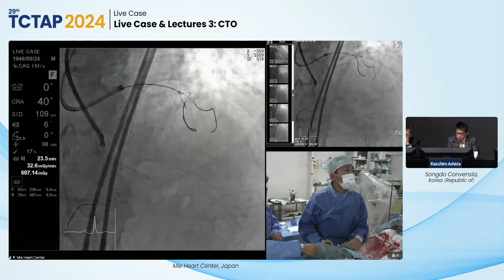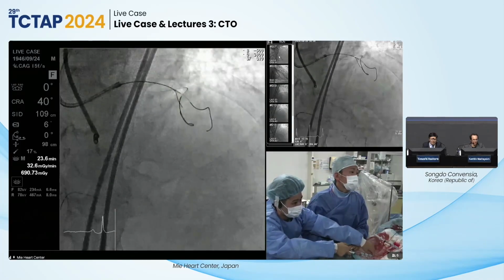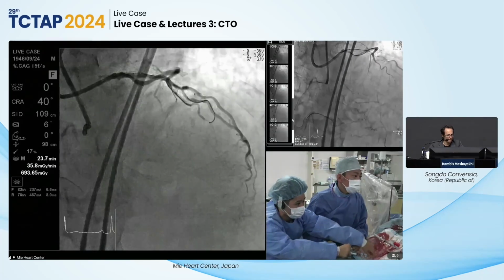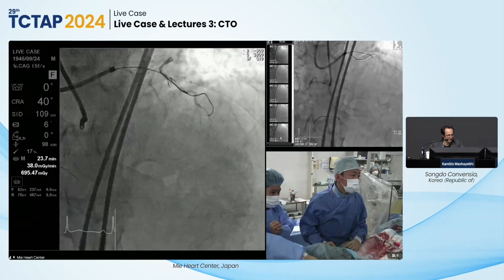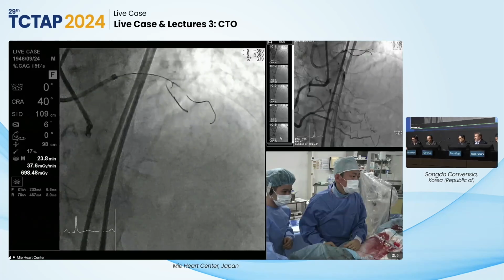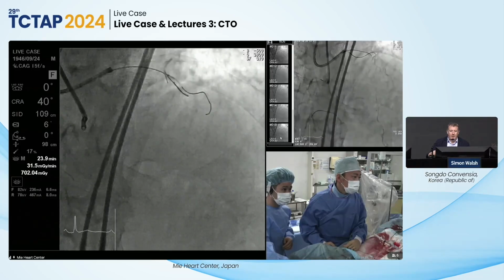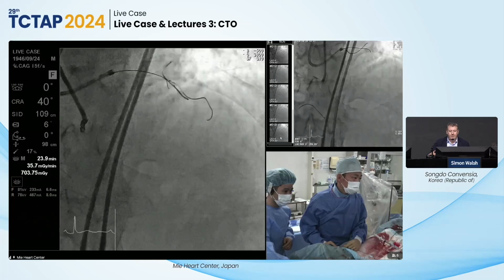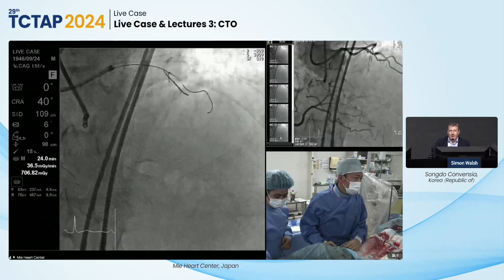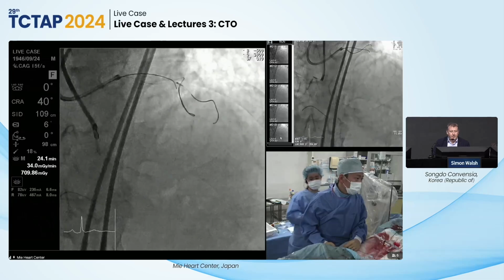So Kenja, are you happy with your puncture? Yes. Now I try to penetrate the proximal cap. Okay. I think the importance of the dual lumen catheter here is something not to miss, because it provides a very stable platform to work from, and I think having a low threshold to use dual lumen catheters is better than having a high one, because it normally puts you into a very steady place to work from. So personally, I use them fairly liberally, and you normally have a side branch at a CTO proximal cap. So I find them very helpful at this stage of the procedure.